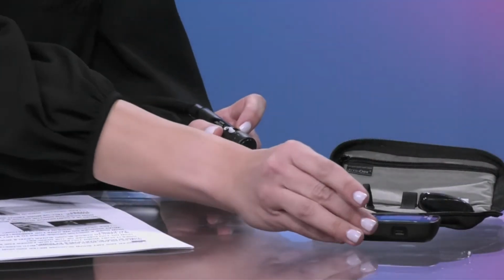Absolutely. So Amy and I are going to walk you through what a typical self-monitoring of blood glucose, or SMBG, is going to look like. Here we have a device that's pretty commonly recommended for patients to use as their blood glucose monitor. The brand of the particular device is going to change based upon your insurance coverage, sometimes your particular healthcare provider's preference. In this particular case, we've got this lancet device and the glucose monitor, which Amy is demonstrating here for you.